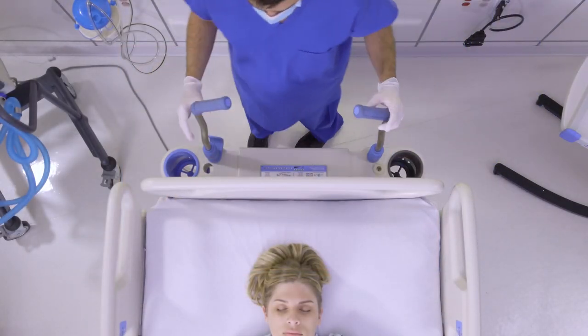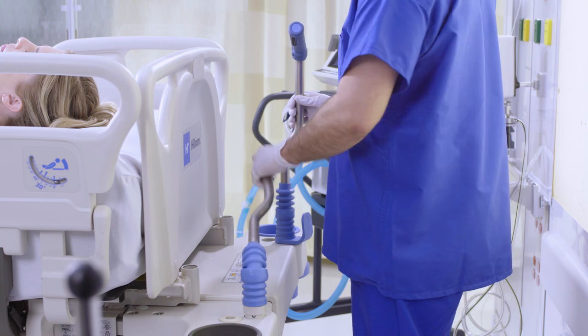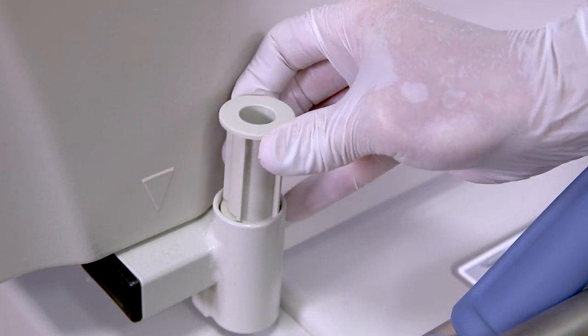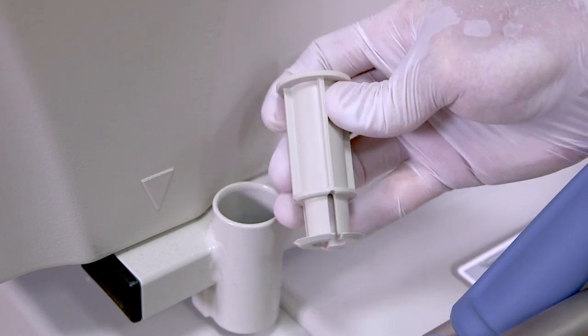Lower the transport handles and IV pole, if applicable. If present, remove the plastic inserts from the traction equipment sockets on the head end of the bed frame.